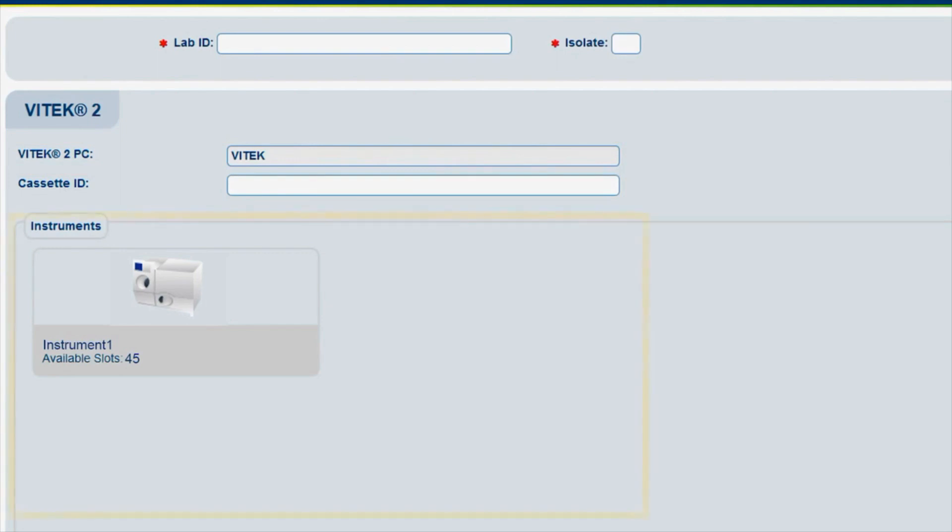The Instruments pane displays what instruments are connected to the Vitek 2 PC. In this video, one instrument is connected.